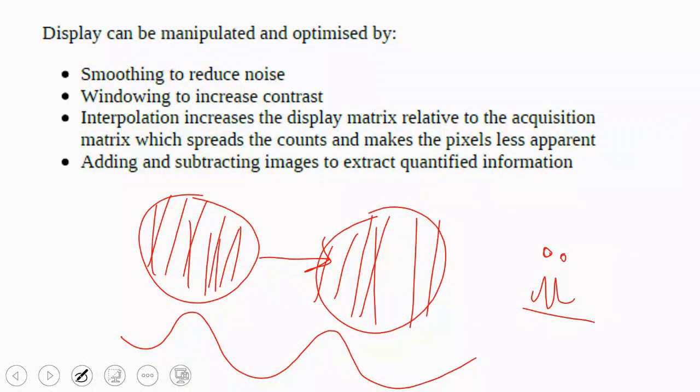Will it be bright for me or not? I should have done something targeted for it to be bright, right? So, naturally, what is the relationship of this bright organ to the background? Keep in mind that inside the patient's body, it is itself bright and the background is completely off, right? And it itself, in terms of size, is my target.